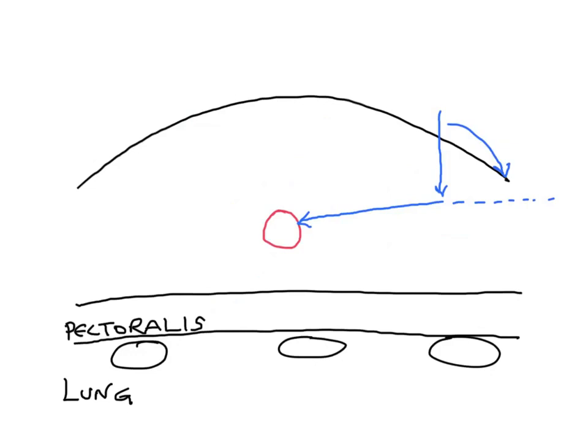So I might do it from here. I'm going to come down a cm or two. Then move my needle down to a more horizontal position and come into the lesion like that.